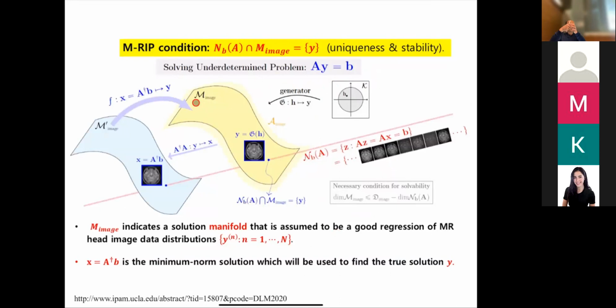It's locally Cartesian, but it can be globally sort of wonky in shape. The deep learning is trying to say, okay, all my solutions must lie on some low dimensional space. And so essentially, I'm going to drive from a bad solution to something that lies on a good solution manifold.